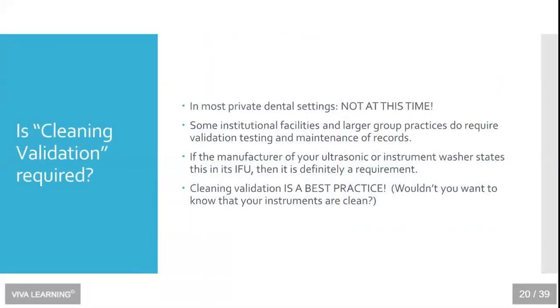So is cleaning validation required in private practice dental settings in the United States? Not at this time, but some institutional facilities say yes, and some larger group practices mandate this as well. If the manufacturer of your ultrasonic or instrument washer says that it is mandated in the instructions for use, then it is definitely a requirement. Even if it is not a requirement, think about cleaning validation as a best practice. Don't you want to know if your instruments are clean?